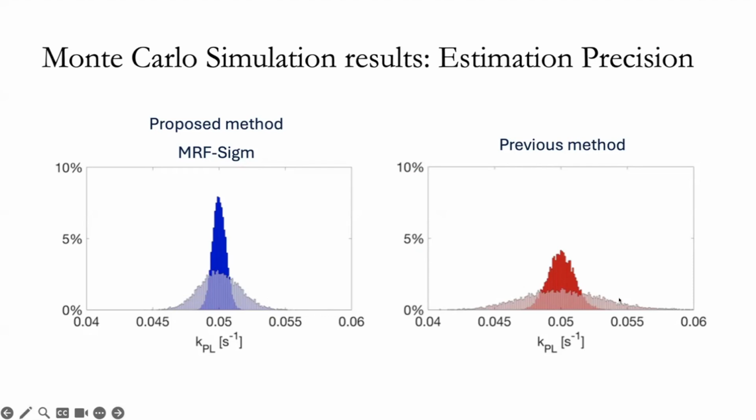And on the right here, that is, again, that previous combined hybrid GRE and BSSFP-based approach with the same two levels of noise as the sigmoid one here, and we just see for the same given amount of noise, parameter estimation using a dictionary-based approach, we have a much larger standard deviation of KPL matching. So this is what the previous figure was summarizing in a much more concise format.